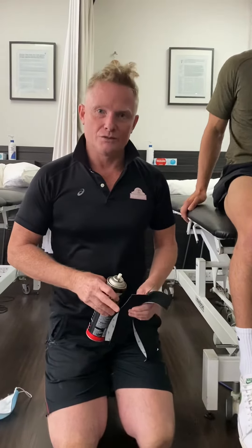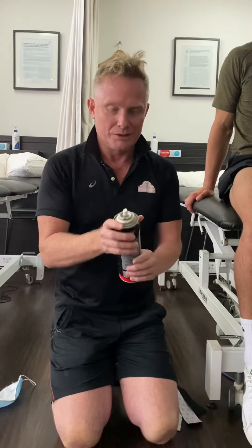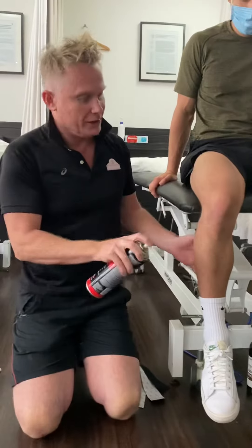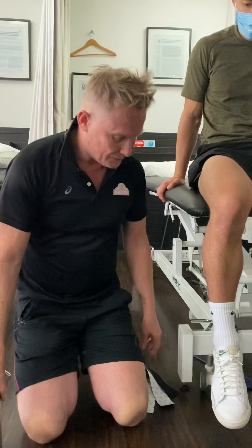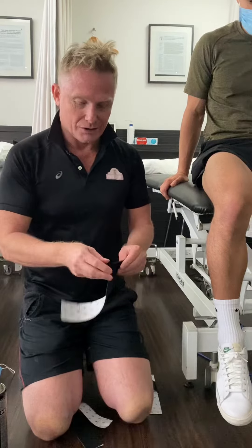Hi, this is an instructional video from orthomethysiotherapy in regards to patellofemoral taping. What we generally tend to use is a glue to start with around the knee. For any athletes who are taping their knees, if we don't glue it, the tape doesn't stay on for more than about 15 minutes. So we like to glue these first.